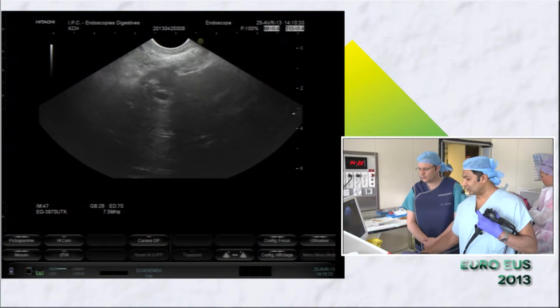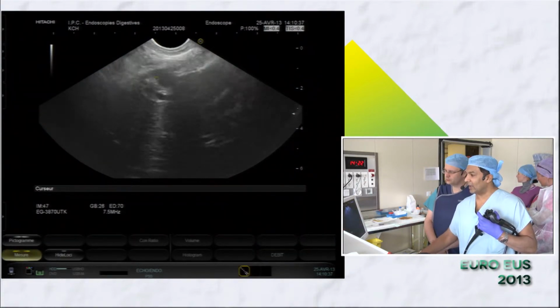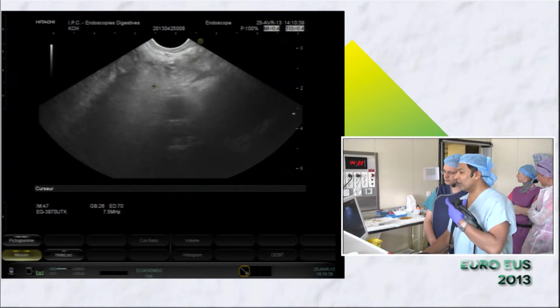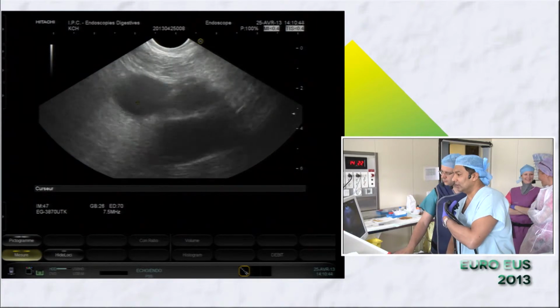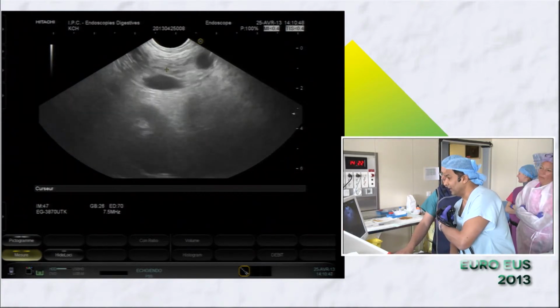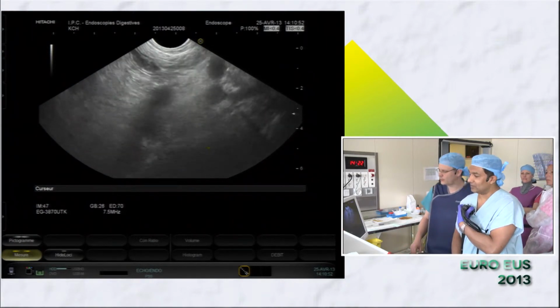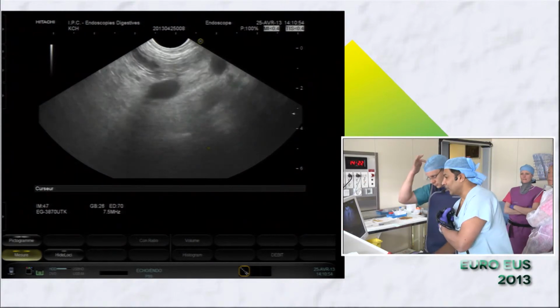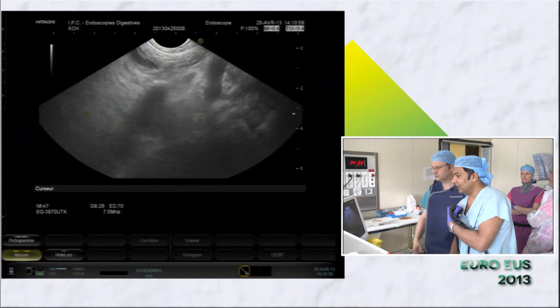And you can really, from this one position, which is really a central position, see the hilum of the liver. When you torque, here's the portal vein. I have to torque quite a lot though because he's on his back. You should be able to see the pancreas, which is above the portal vein. Okay, and this patient doesn't have a head of pancreas. Remember, he had a Whipple. But from this position, usually you can still see also the head of the pancreas down here.